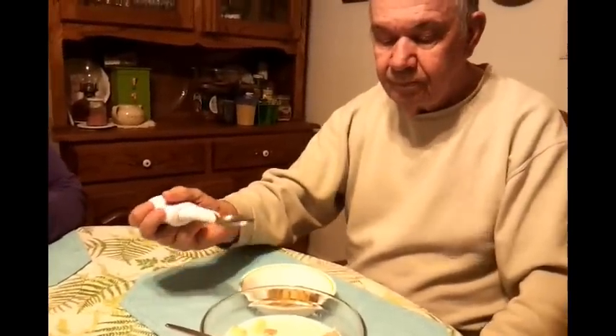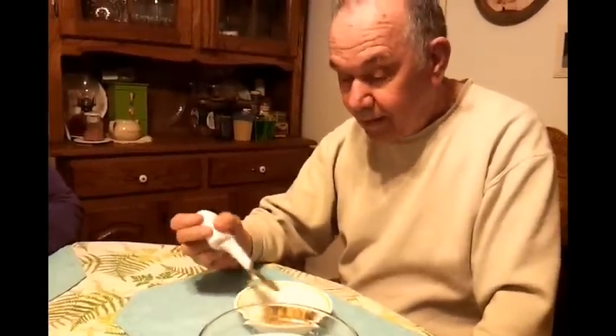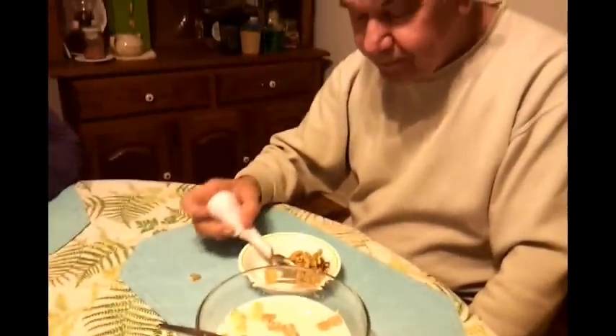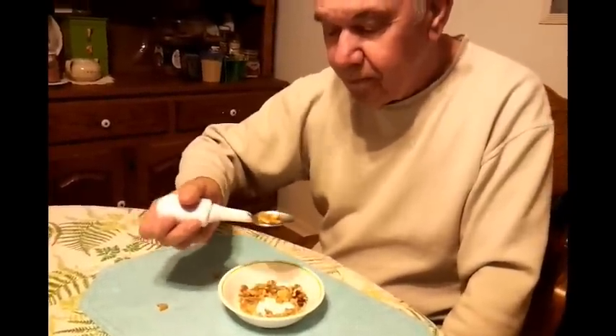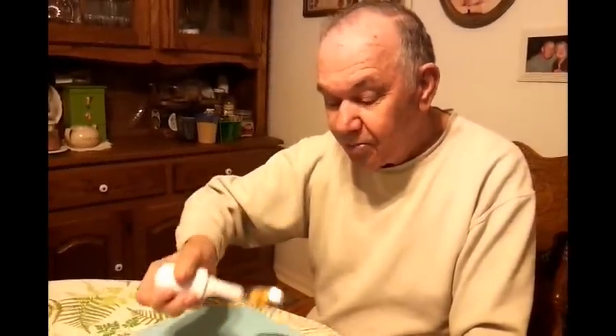Try a bowl of nuts. Wow, I heard it. That is fantastic. Try that with a regular spoon. It's very good.